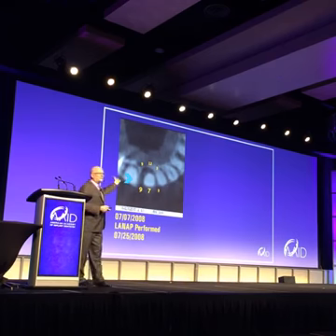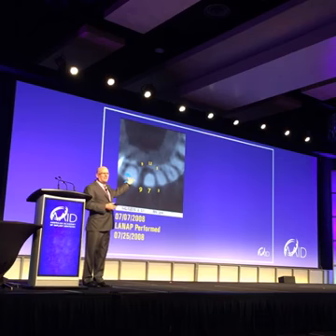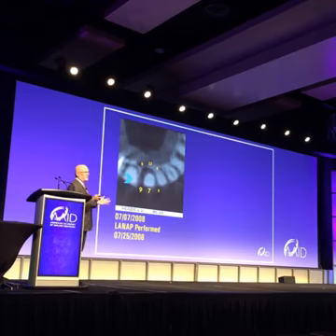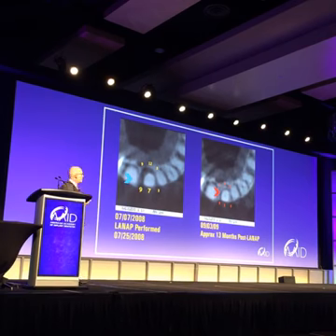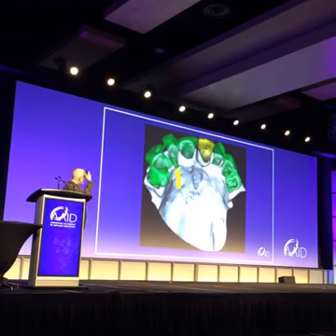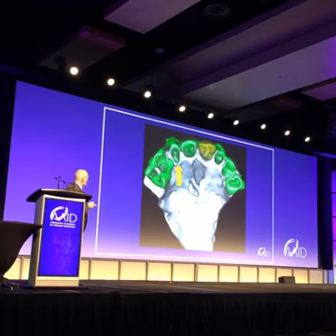How many here would take that tooth out? On number 9, this is a lady in her 70s. How many here would take that out? Everyone told her to take that tooth out because get an implant done. We ended up treating her. 13 months later, complete bone fill with 3mm pockets. And just to show you, that arrow should be over the number 9 tooth. You can see the defect, and now you can see how it's filled in again. Well, that's not an implant 3D study that I did.